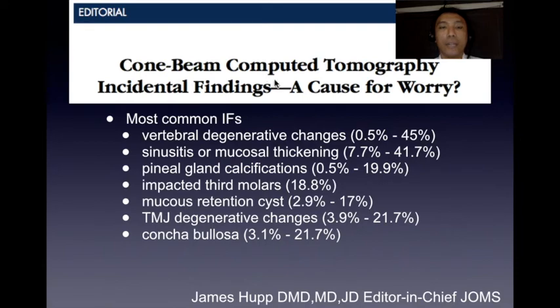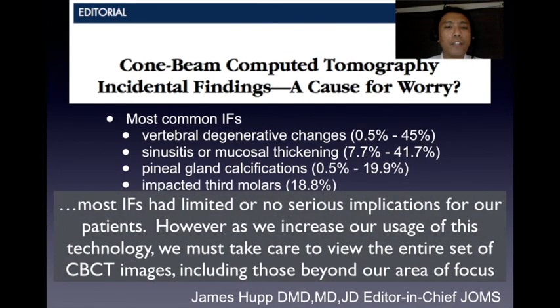In his editorial, he looked at a lot of different incidental findings, and he eventually said that most incidental findings have very limited or no serious implication to our patients. However, as we increase the use of this technology, cone beam CT scan, we must take care to view the entire image itself and not just concentrate on what we are doing. Implant sites, impacted molars, incidental findings are there.